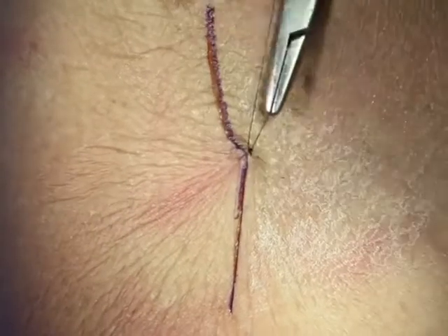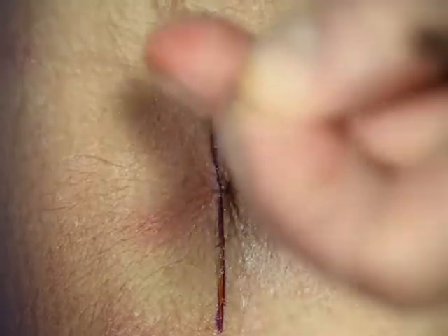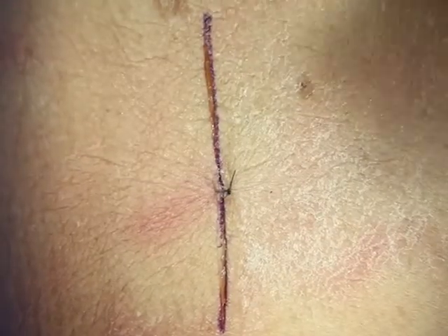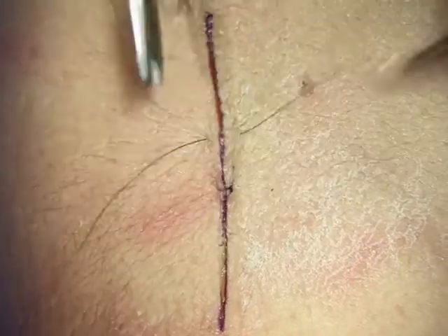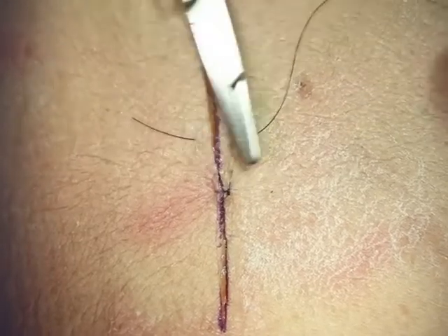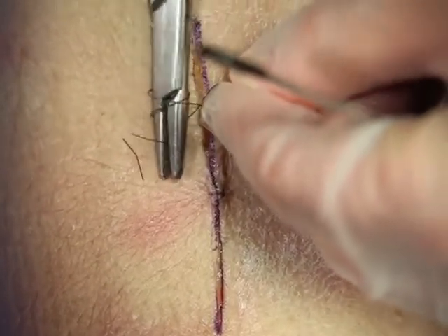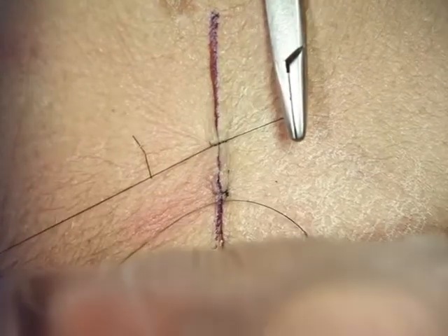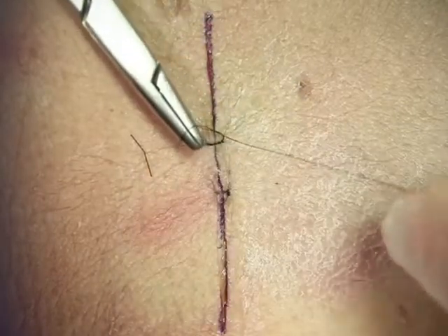I recommend at least three throws — instrument between, bring the small end to the other side, and done. Some suture material you may need more throws, something like an absorbable suture. This is a very basic technique; it allows you to suture in a small place. Notice I like to keep the short end very short so your instrument doesn't move around very much. Keep the needle driver between the two, grab the small end, pull it to the opposite side squaring your knot, and lock it down with that surgeon's knot.